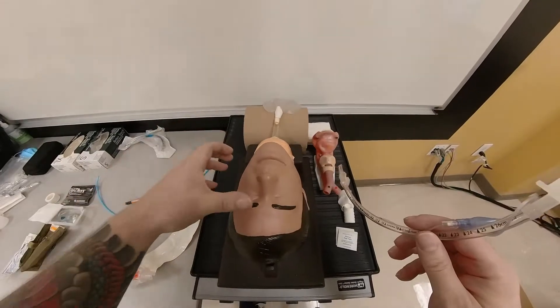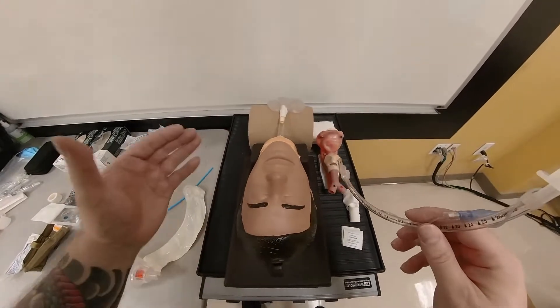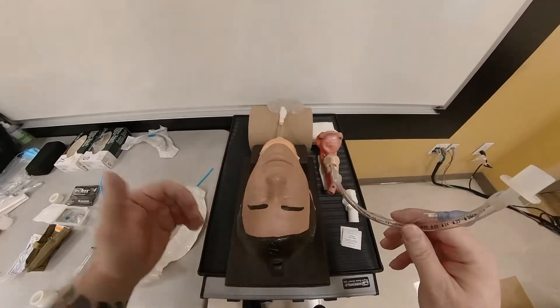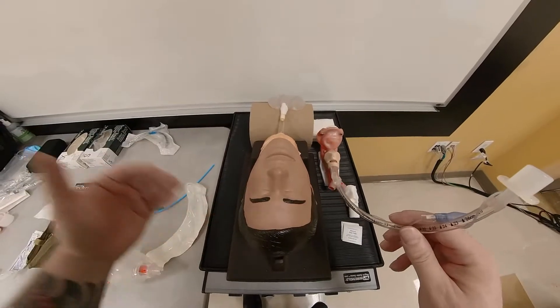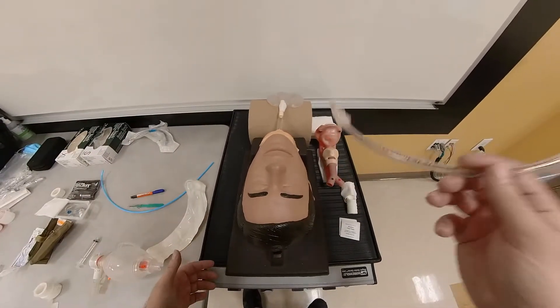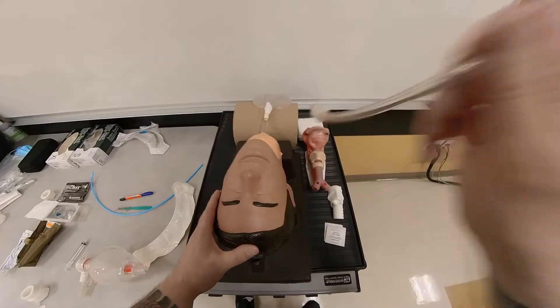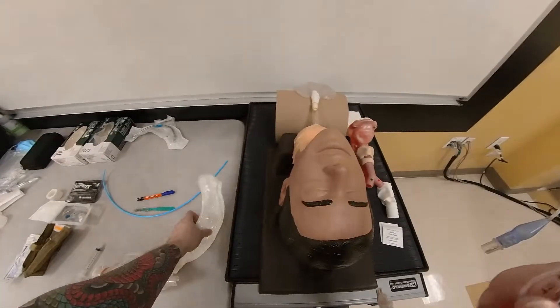We've determined we cannot squeeze the bag to ventilate the patient, even with good positioning, OPA, NPA. We cannot intubate, even with good positioning and video laryngoscopy. So now we've made the decision to go ahead and perform surgical cricothyrotomy.